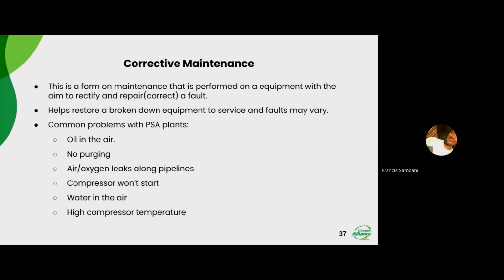Check the condition of the air dryer itself. Is it clean? The air dryer needs to be clean. It has a fan blowing on it. If you have dust or dirt coating the pipes along the air dryer, that will reduce the effectiveness of the fan. Is the fan working? That might also be something you have to look at on your air dryer. So those are some of the things.